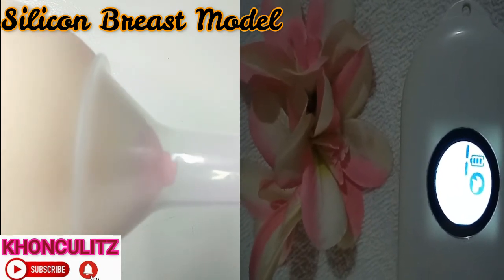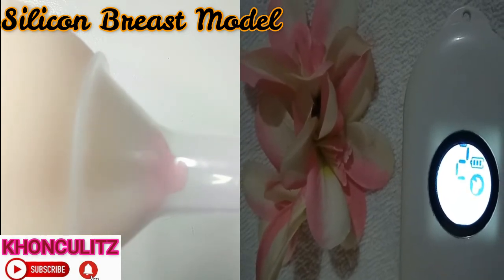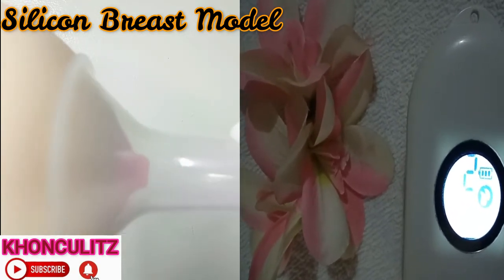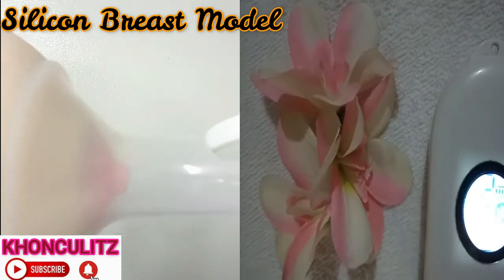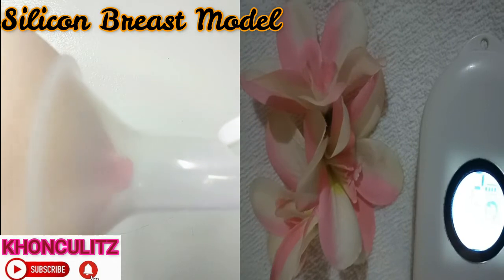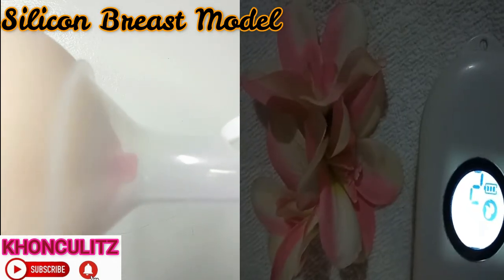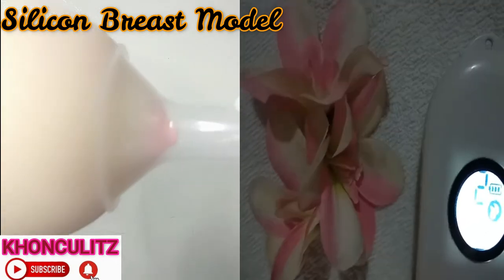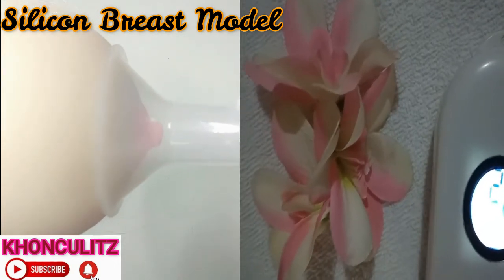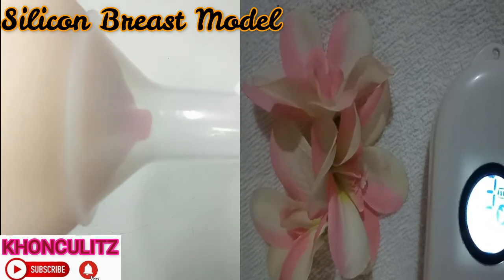Let's have expression mode number two. This is number two in expression mode. This is actually the flange of Wise Mom Pocket. But again, the demo flange is bigger than the demo breast. Let us have massage mode number three — so that's number three.